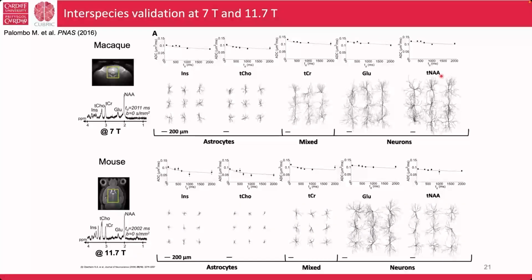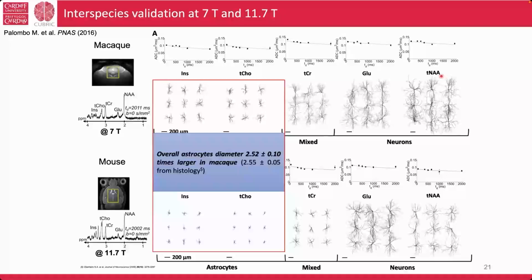So back then, we simplified the measurement and the modeling a lot, but it required some sophisticated diffusion-weighted MR spectroscopy protocols to acquire this data. Anyway, the bottom line is that we were able to show that we could estimate the most likely cellular microstructure that originated the signal in very good agreement with histology, not only at the individual species level, but also across species.